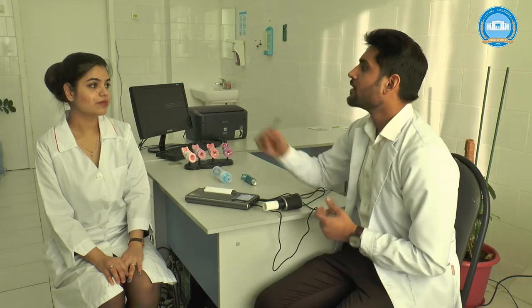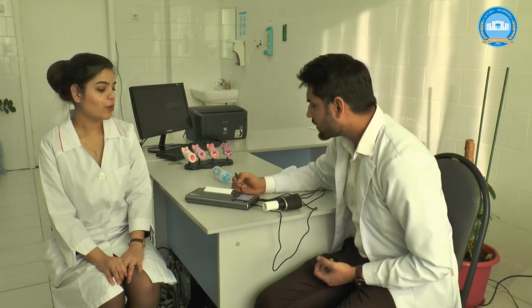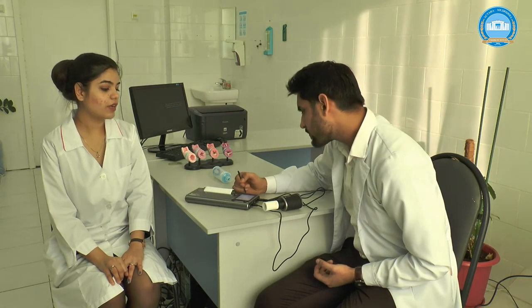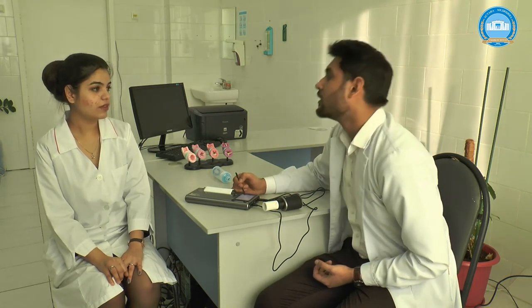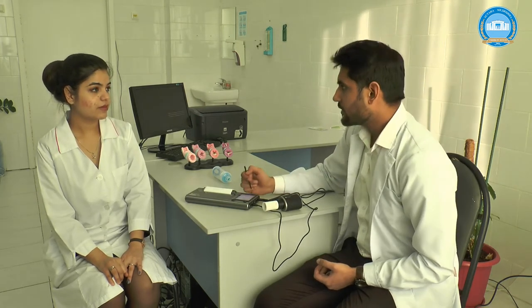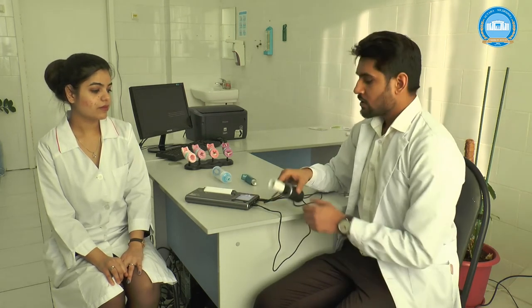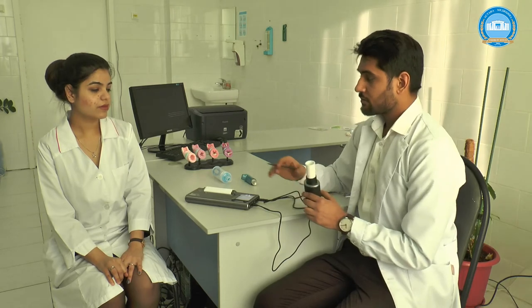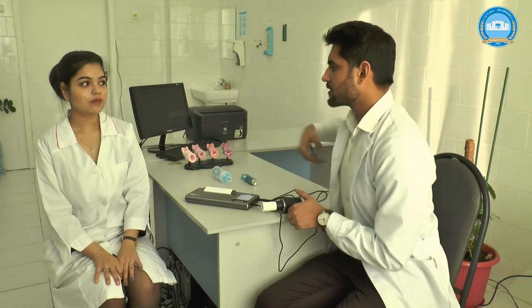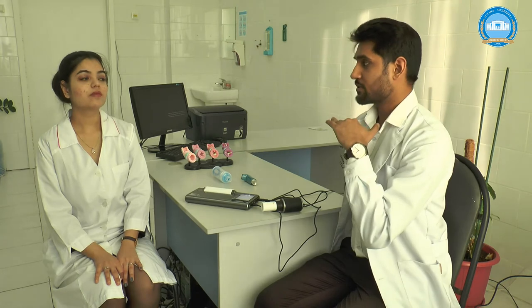Measure the patient's height and weight, and enter the patient data into the spirometer. Correctly seat the patient in front of the spirometer — the patient should sit with a straight back and slightly raised head.